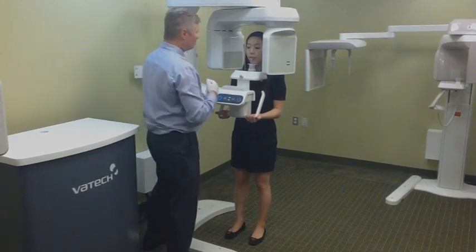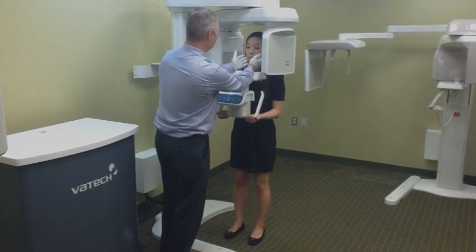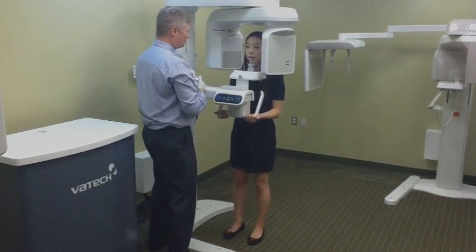Okay. So what I'm going to do now, I'm going to adjust my mid-sagittal. So I need to touch your face here a little bit. So I'm going to move you over just a little bit here. So light's going in between the philtrum here and between the eyebrows. From here, I'm then going to adjust as far as our Frankfurt light.